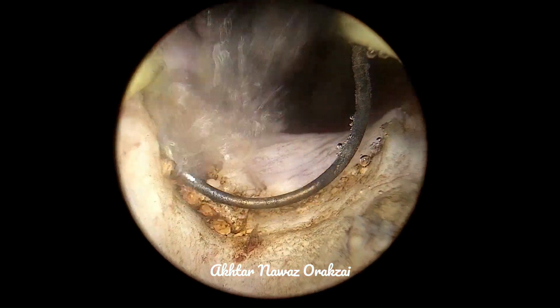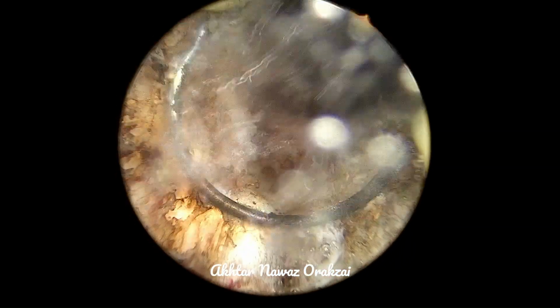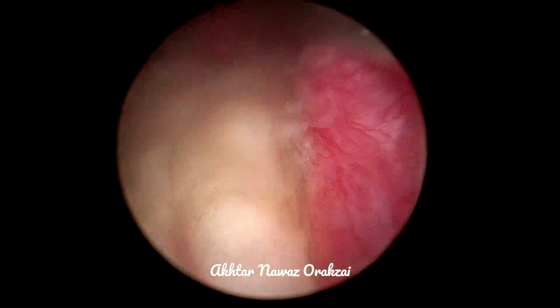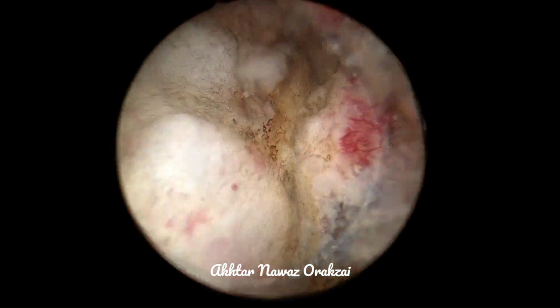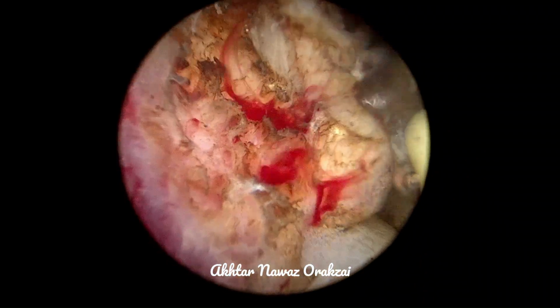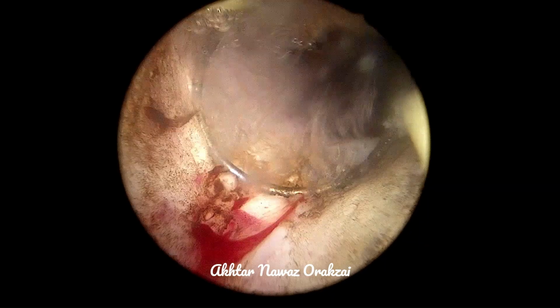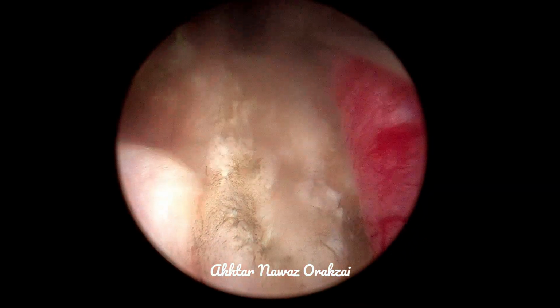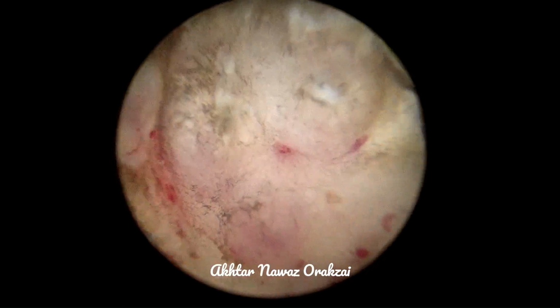So resection of the median lobe is continued until, number one, the fibers of the bladder neck are visible, and number two, a sufficient crater is created for the fluid movement and circulation.